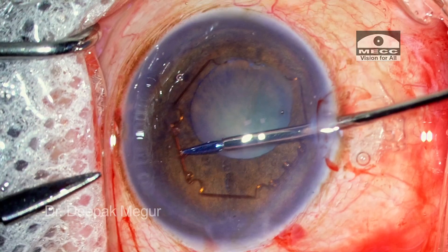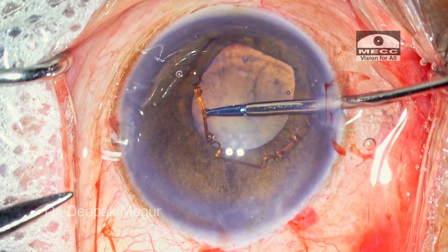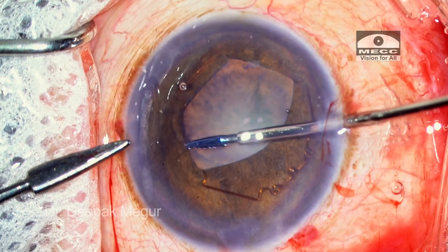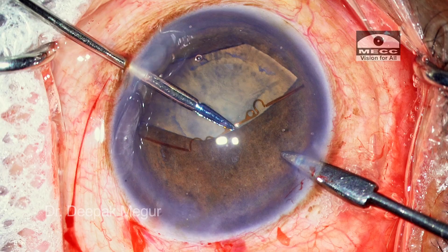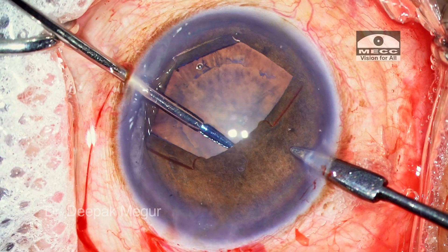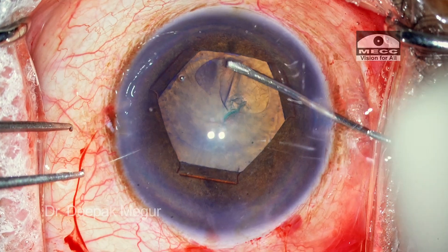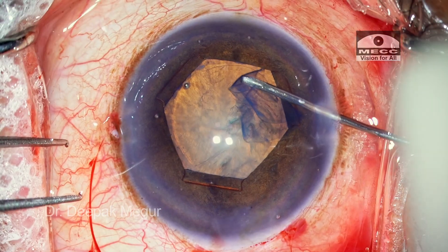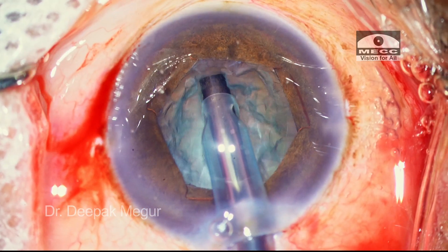This is a non-dilating pupil and she's prepared well for it. She's going to implant a pupil expansion device — she's going to use the Bhex ring. This is probably her second or third device in usage and she's done a reasonably good job. The implantation of the ring was spot on. Now is the time to perform the rhexis, which is around 5 mm. So far so good; the sculpt is being done.